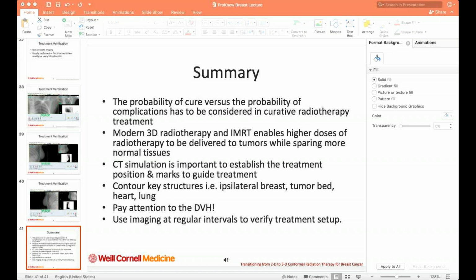That is a great question. I think it differs. It's all based on how your system is set up, right? In the system in which I practice, it doesn't make a difference for us if I hypofractionate or not, so I just hypofractionate to save patients time.